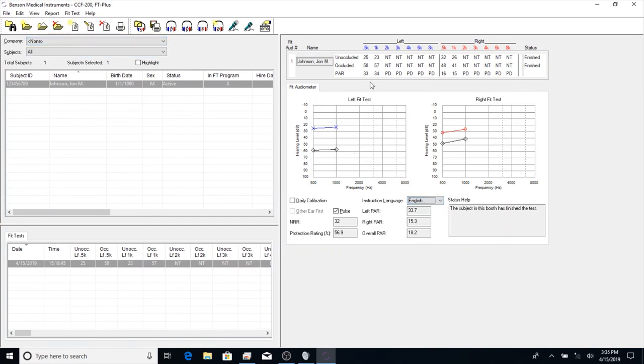You may have noticed during the tone presentation that the thresholds are determined using modified Hughson-Westlake in blocks of 5. Once that threshold determination is made, it does it down to 1 dB.